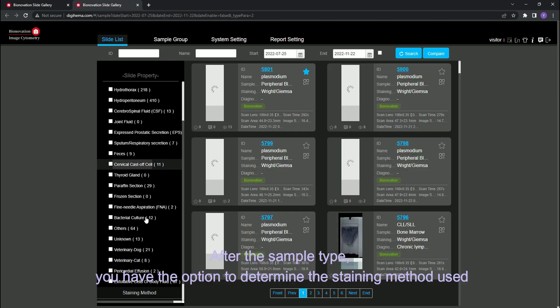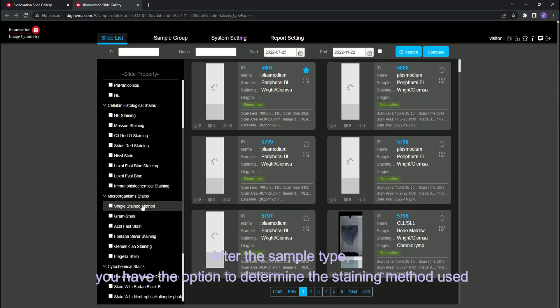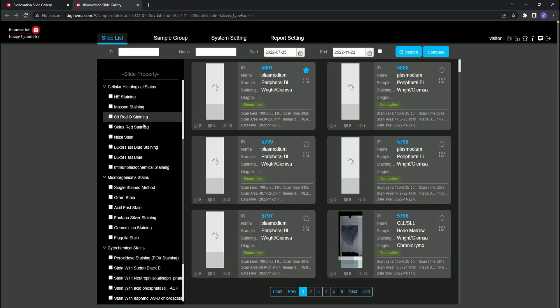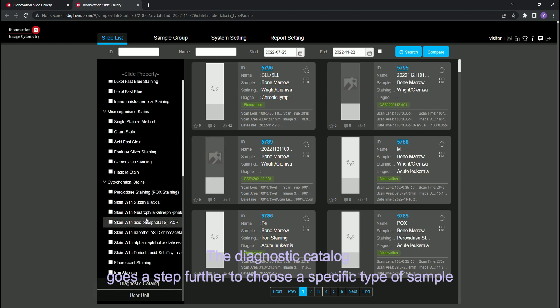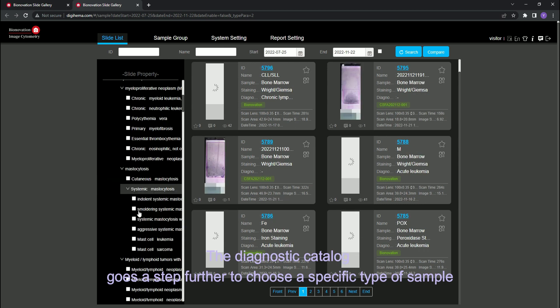After the sample type, you have the option to determine the staining method used. The diagnostic catalog goes a step further to choose a specific type of sample.